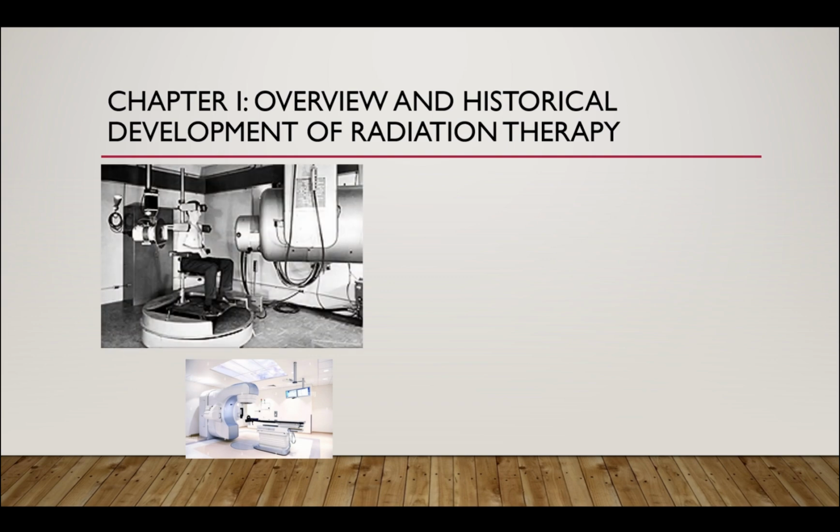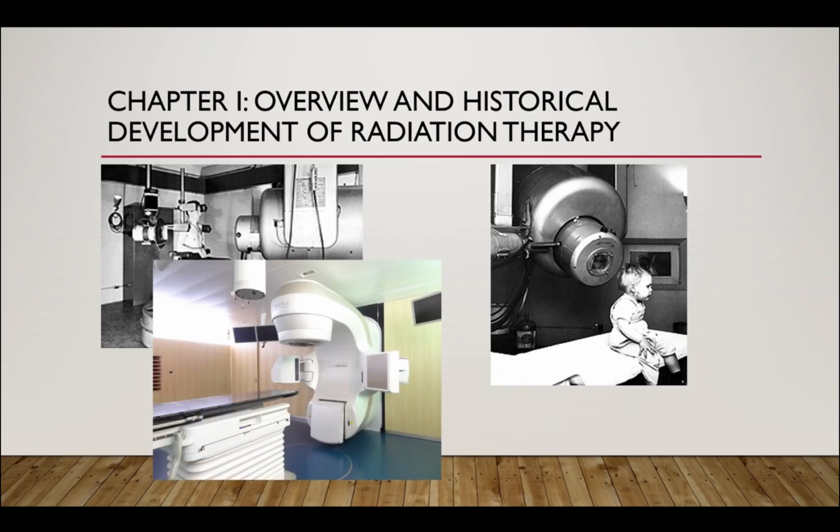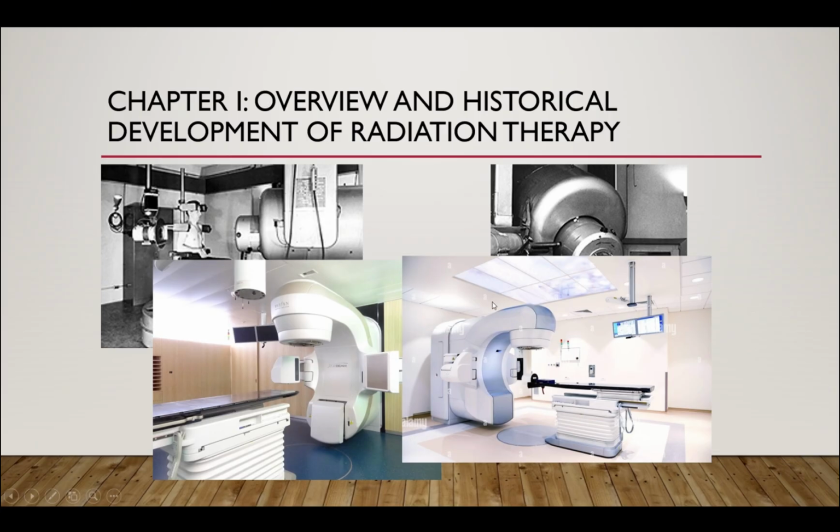And these images are the pictures of the development of radiotherapy throughout the years. Looking at the pictures, we see that the machines are quite large. They are quite large compared to our modern radiotherapy units, such as this. So, this is the modern linear accelerator. I'm showing you these pictures so that you have a clear picture of these machines as early as now. But we will discover and discuss more of these machines and units in the following chapters. So again, this is another image of the modern linear accelerator.